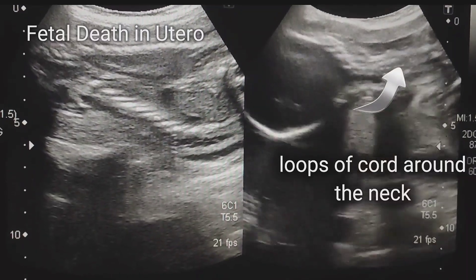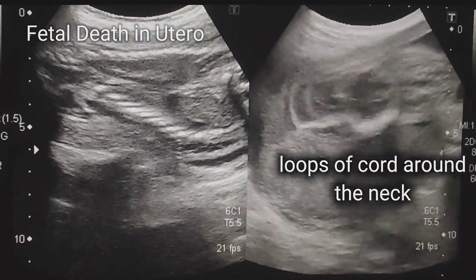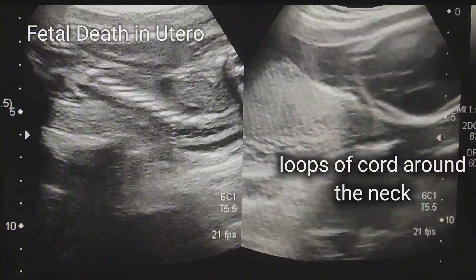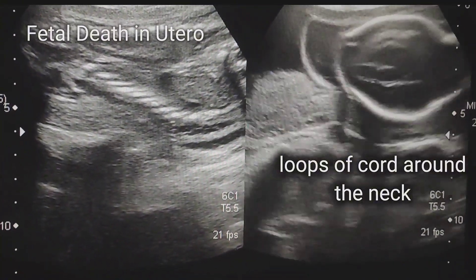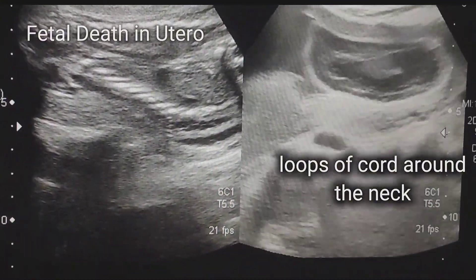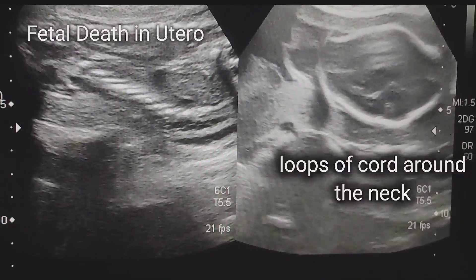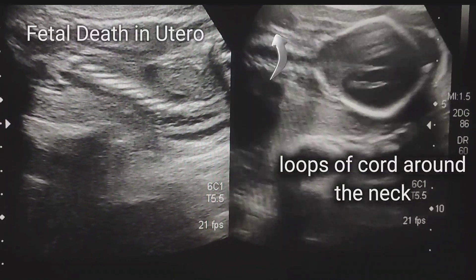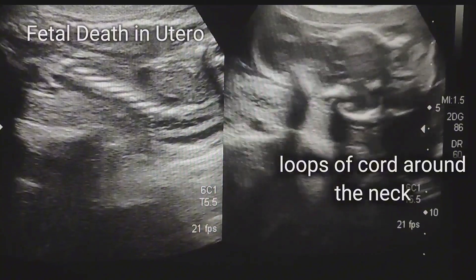Here we can see a triple cord around the neck. Multiple loops are seen compressing the neck of the fetus, which can lead to hypoxia and fetal demise.